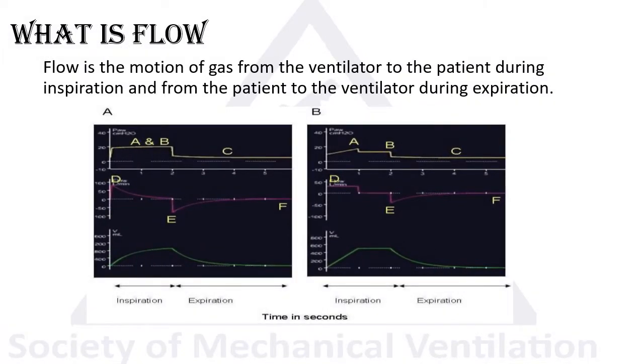So what is flow? Flow, by definition from physics, is the motion of the gas from the ventilator to the patient during inspiration and vice versa, from the patient to the ventilator during expiration.